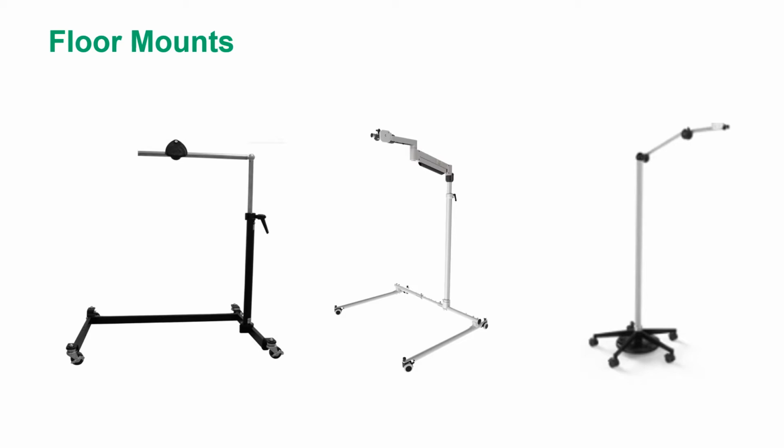Floor mounts can be used by anyone needing a device mount. As I said, they fit well around big items such as wheelchairs or armchairs. They roll under and around beds, tables, and desks. Floor mounts are used to give flexibility in multiple situations.